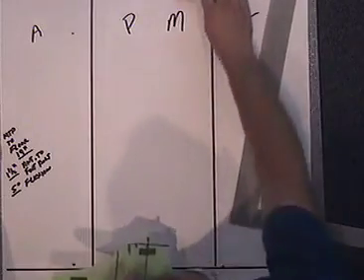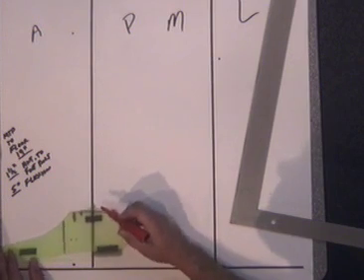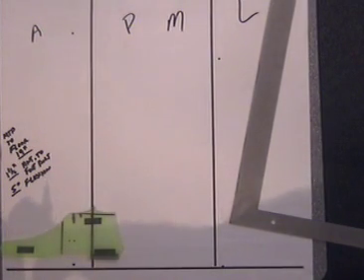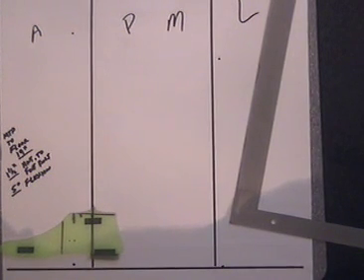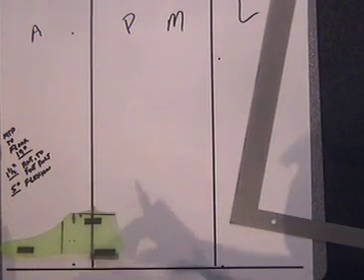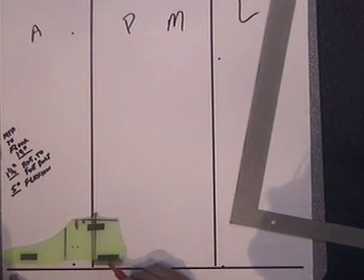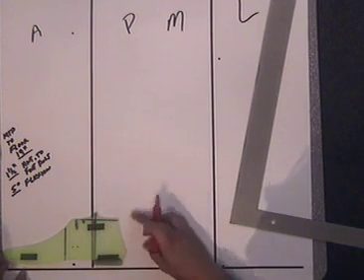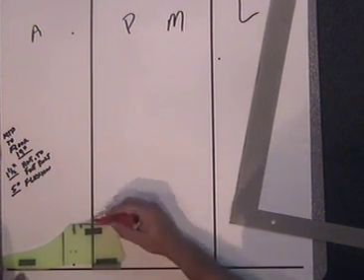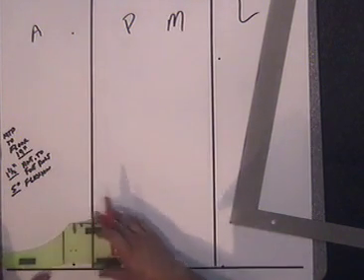Okay, when we do our bench alignment, we need to first set up our foot. So this black line is going to represent the floor. This black area here on the heel is our heel height, and this is the bottom of our heel right there. So if I place this foot with the ankle bolt, it should be right here on this line here, that would be a nice setup for a sagittal plane view of the foot.